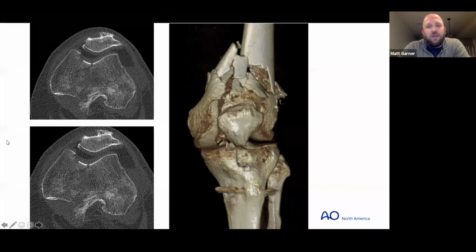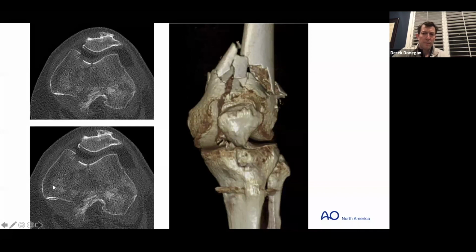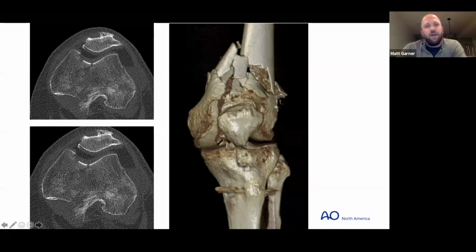So I would really consider an intramedullary fixation on this, not necessarily because I think you need it from an overall fracture healing and construct standpoint. I think it's going to increase the longevity of your construct, and that medial side may take a while to heal. Yeah, I think I would not go medial on this. I don't think I'd put a medial plate on this.